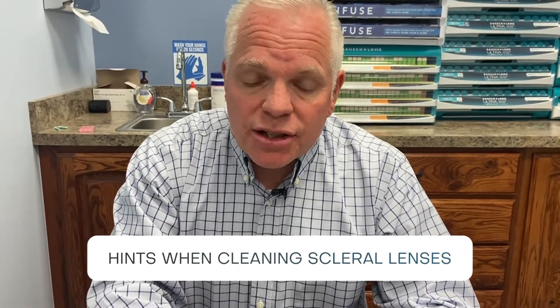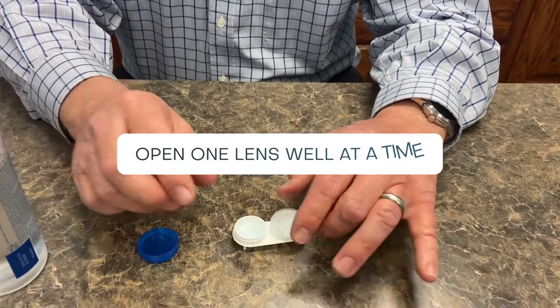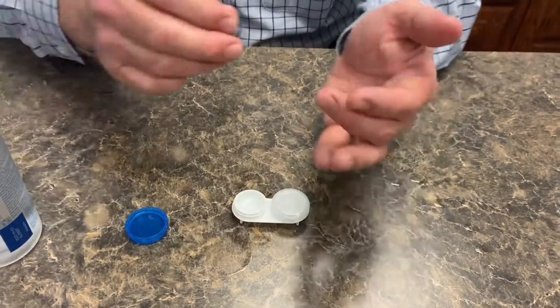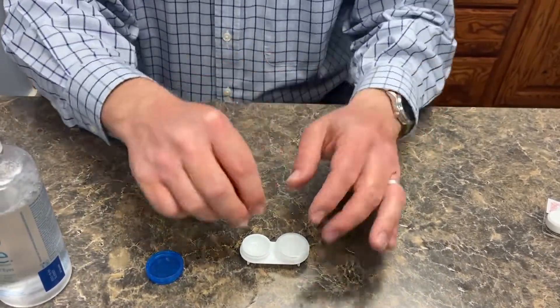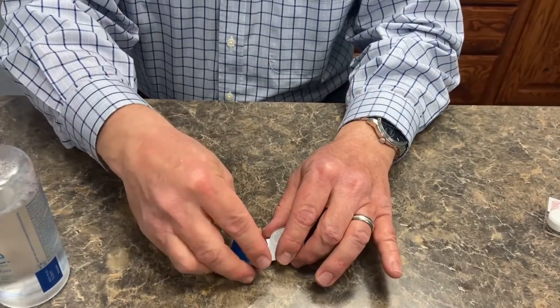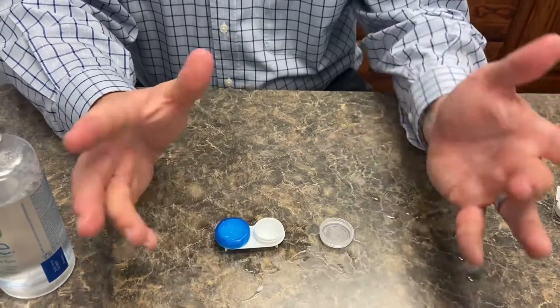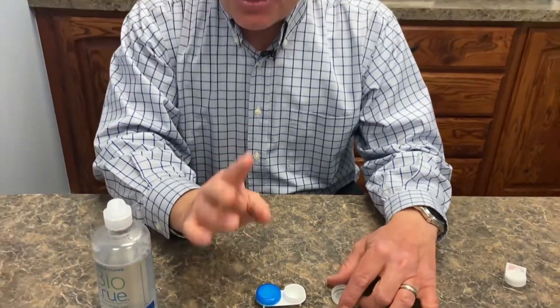A couple hints when cleaning your lenses. Number one: only open one lens well at a time. If you're going to clean your right lens, take your right one out, clean it, put the solution in it, set it in, and close it up before you open your left well. This is really going to help you from mixing up your lenses and save you a lot of headache and hassle in the long run.